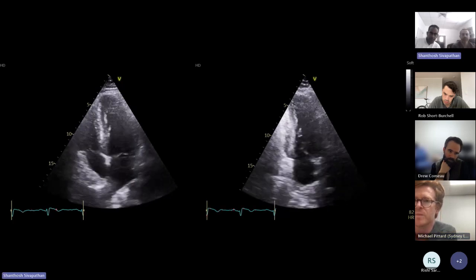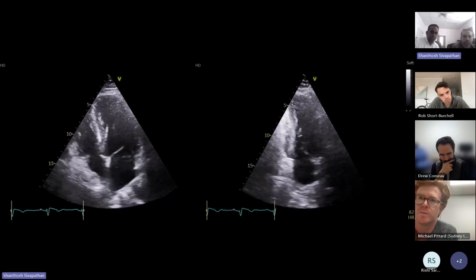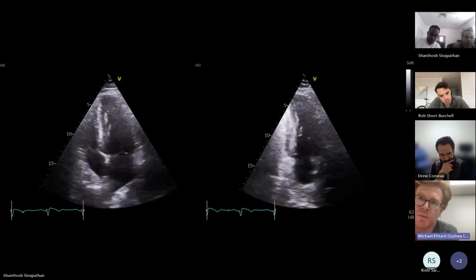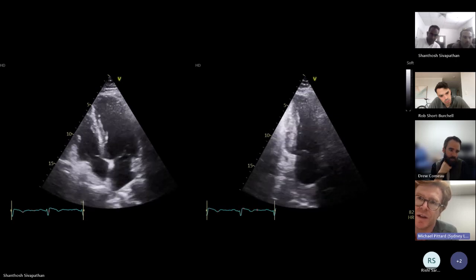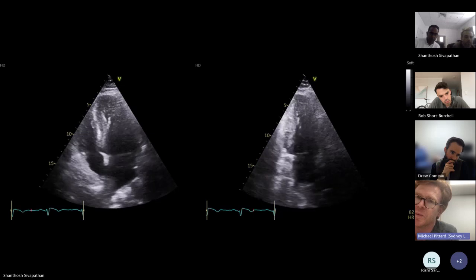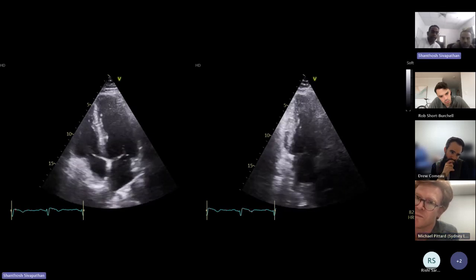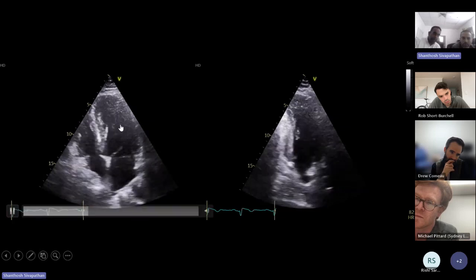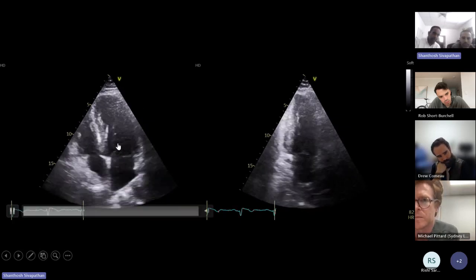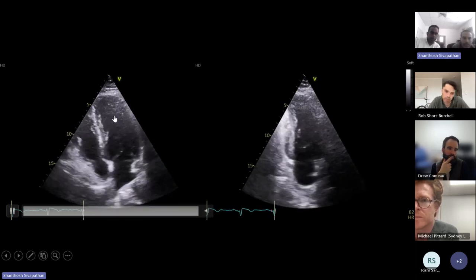Yeah, in the 4 chamber, which segment is probably the most hyperkinetic? I think it's the basal and mid inferoseptum. Yeah, 100%. I think I probably agree with you there. And it is a bit difficult to say. I mean, you can't really see the lateral wall as clearly as you'd like, but I think it is coming in nicely there. And you can definitely see that mid-septum, the apex, that's all coming in nicely.